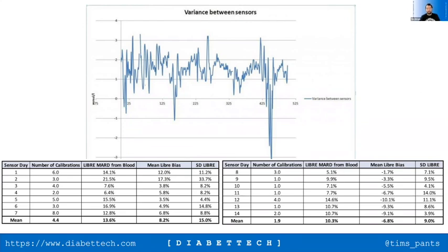Even with the Dexcom G5, you weren't 10 to 15 minutes behind. There's a story in the marketplace amongst users that Libre is 10 to 15 minutes behind, but none of the data supports that. And to be honest, the technology in Libre 1 to Libre 2 isn't really any different. Libre 2 technology is essentially what's being used in the Libre 3 as well.